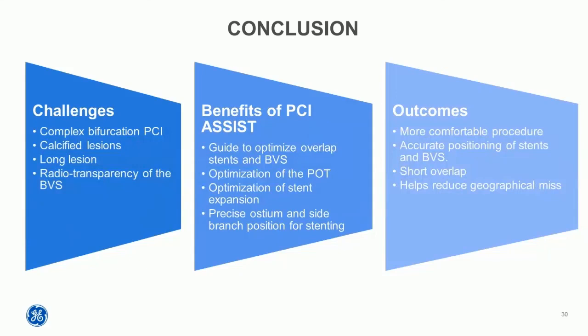So my conclusions will be that this tool is very helpful in daily practice for complex bifurcation PCIs, especially when the vessels are also calcified and fibrotic, because it is very important also to check the fact that the stents are well deployed in the vessel.